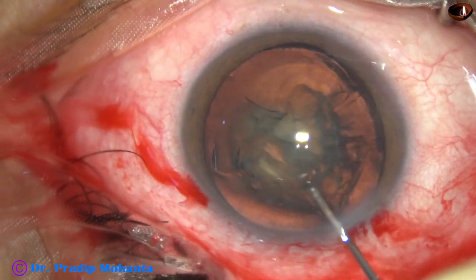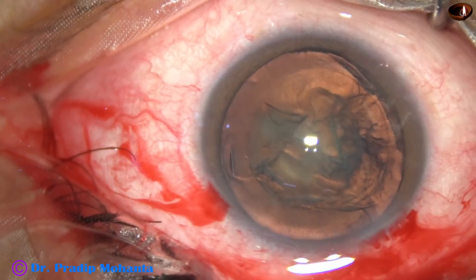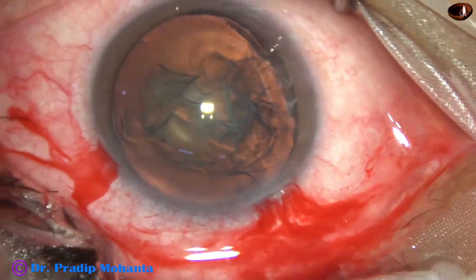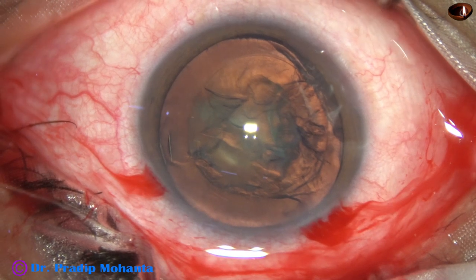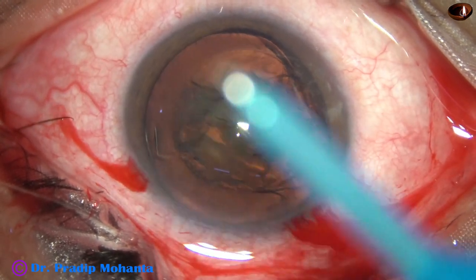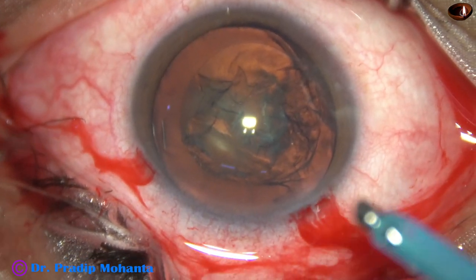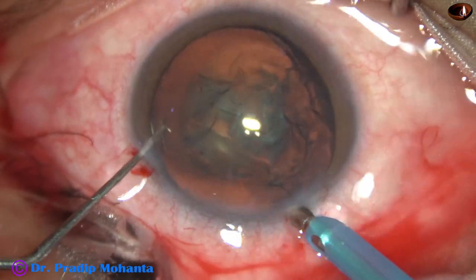In such cases, even a pre-chopper is not required. When the nucleus is so soft, you can just suck it out. Just go with high vacuum and aspirate the mass. If necessary, a little bit of ultrasonic energy is applied in between.